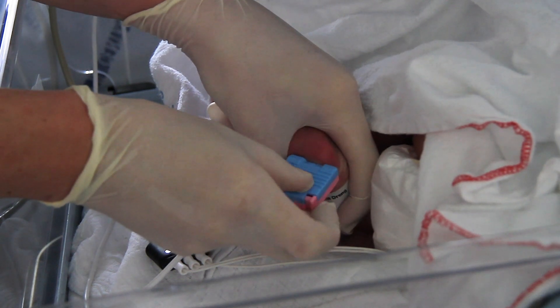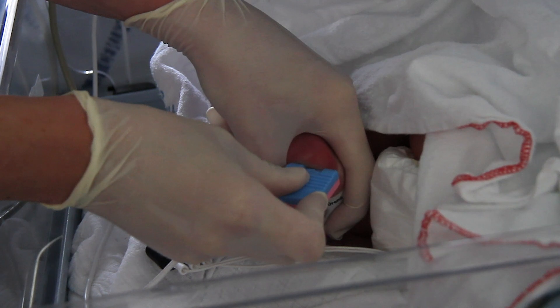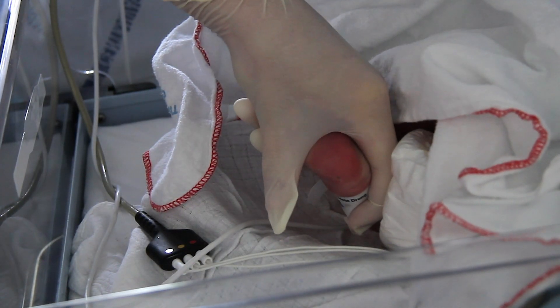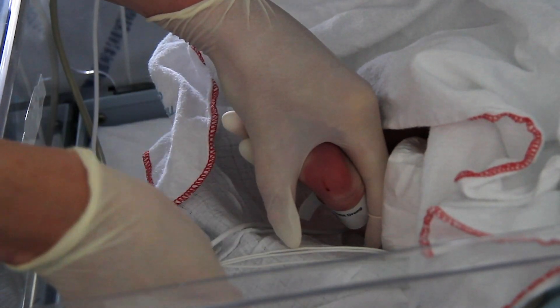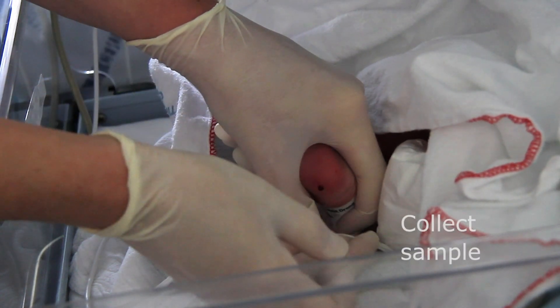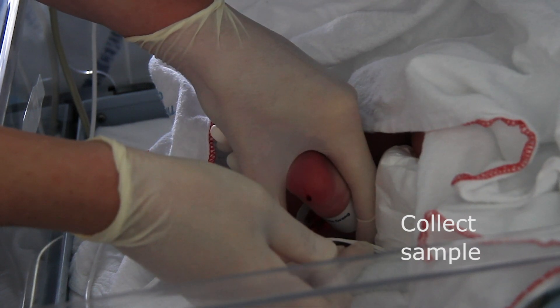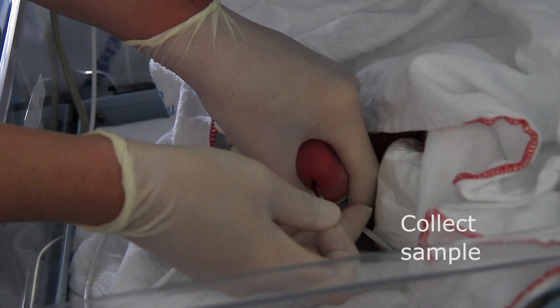Make an incision of maximum 2 mm depth on the plantar surface of the heel. Wipe off the first drop of blood. Hold one end of the capillary tube horizontally into the forming blood drops, filling the tube and keeping air out.